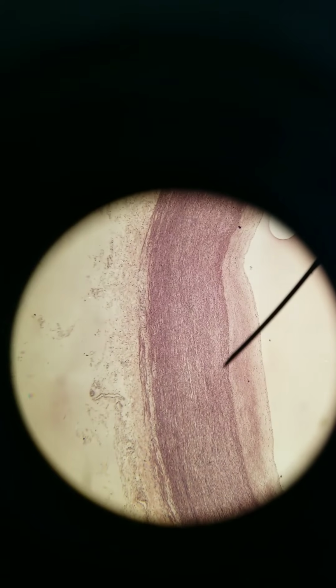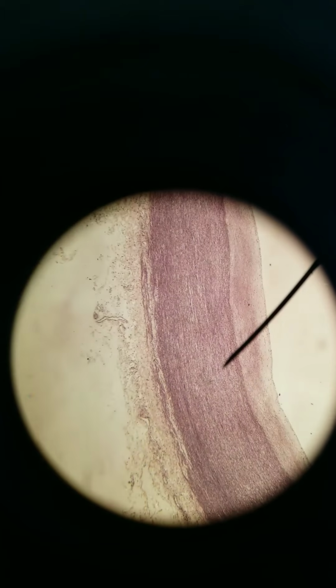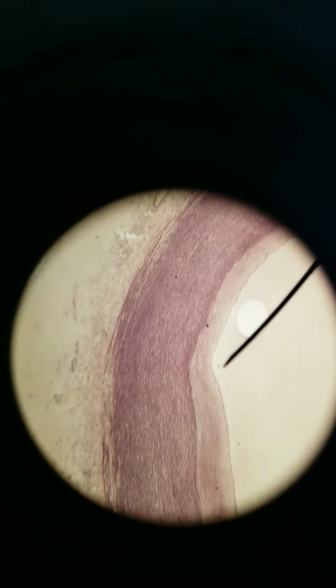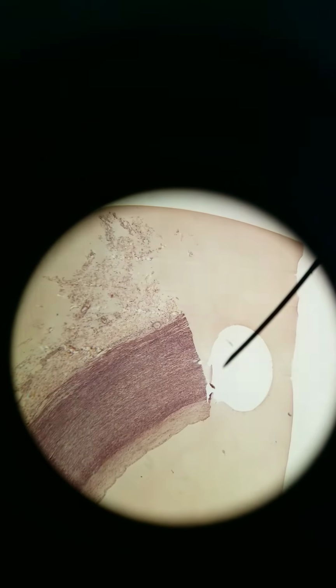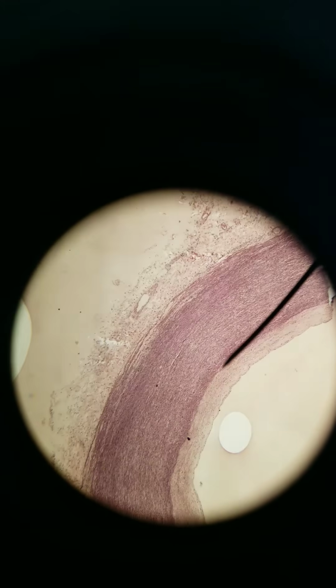Hey everyone, we are taking a look at histology of the aorta currently. It's a cross section. So blood vessels are circular, they're tubular. So this would form a full circle. It's obviously cut off right here, but if we kept going around, it would form a full circle and then come around again. So we just have one arch of the aorta.